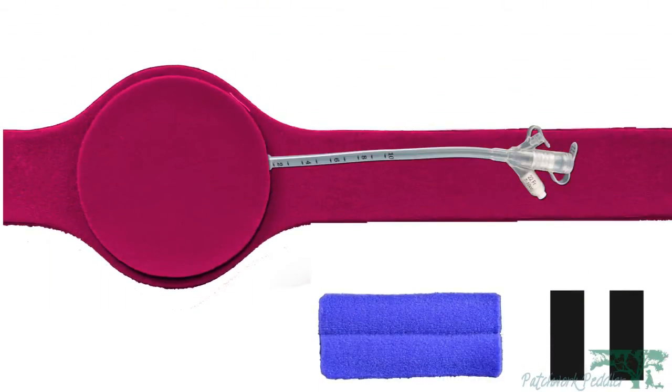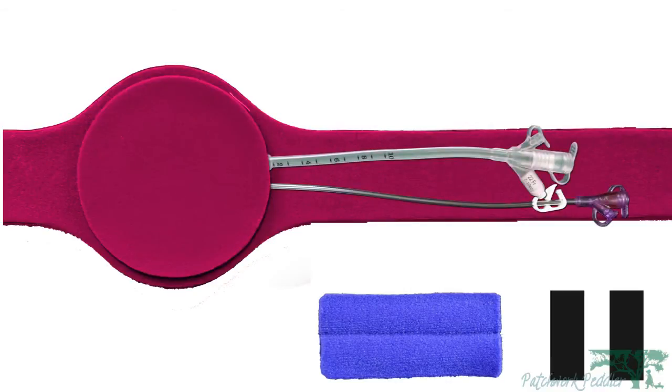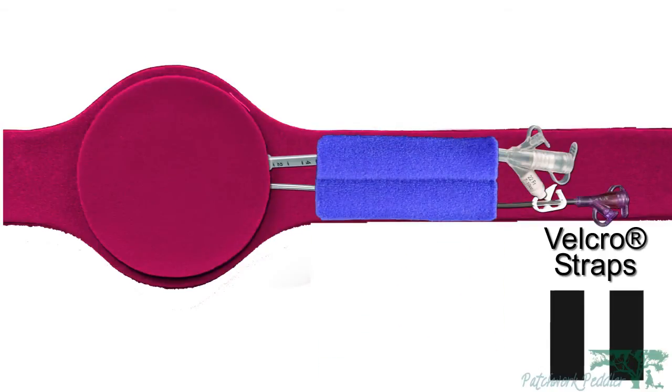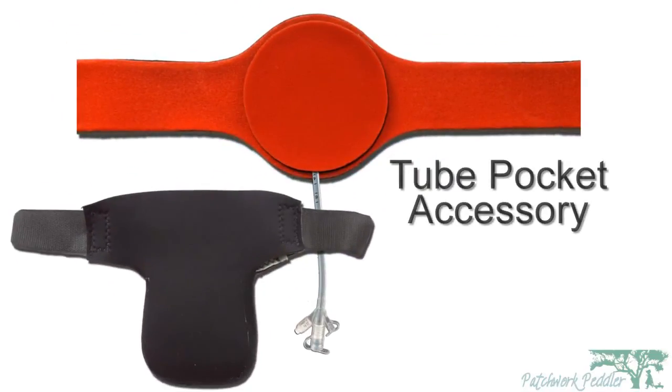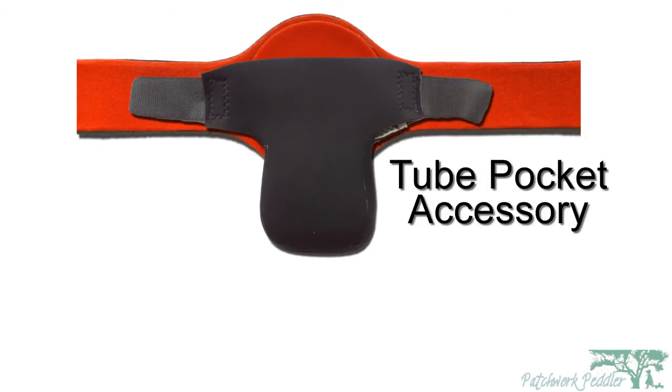Whether you have the traditional Feeding Tube or the button, one line or two, we have accessories that are just right for you — whether it be the tube holder or our Velcro straps. Additionally, Patchwork Peddler offers these tube pockets for you to store your Feeding Tube in.